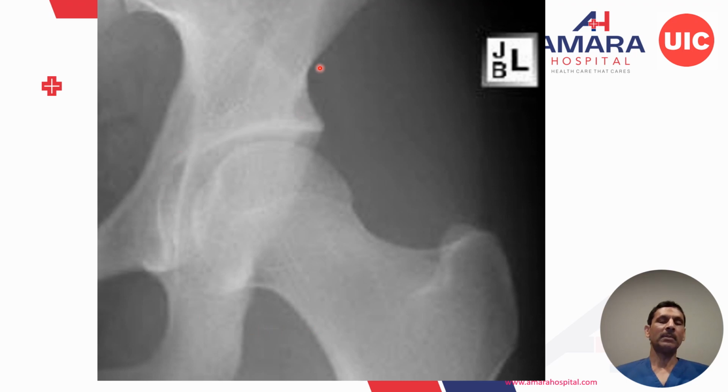So on the left hip, there are no pathological lesions, grossly. The head seems reasonably round. The problem is the physeal line is not perpendicular to the neck. It's extending onto the neck superiorly. That's called the epiphyseal extension sign, which is a sign of cam morphology. So you can tell that this head probably is not perfectly round like it looks here. Somewhere here there'll be a bump at the head-neck junction, right?